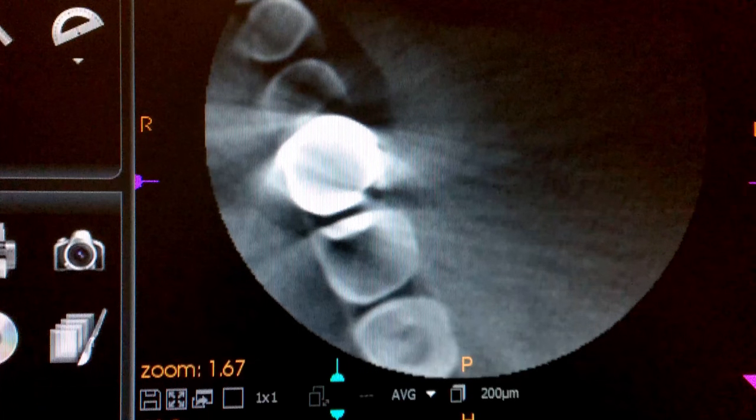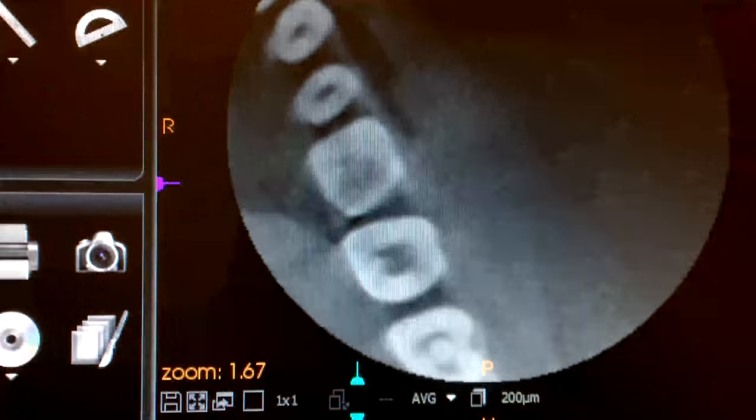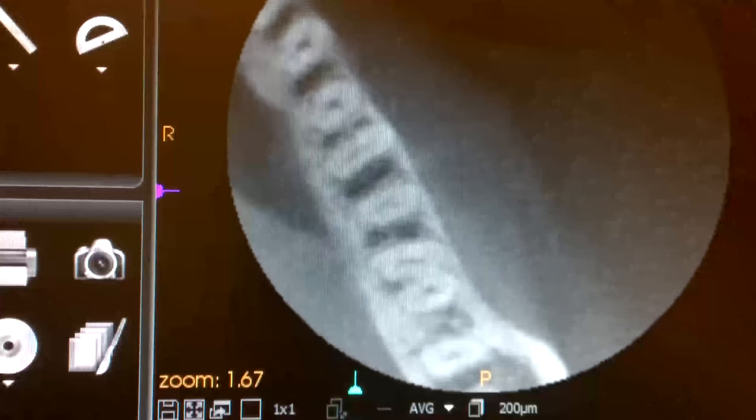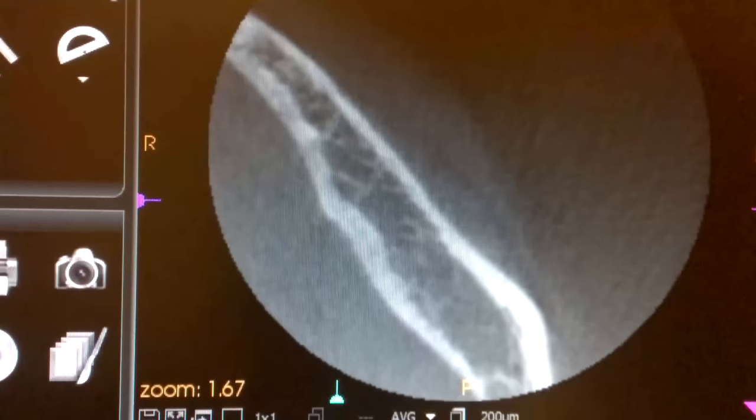On this cone beam, you can see the extra white area is actually a crown. As we continue to scroll down, you can just see the two roots there. Now we're down to only the jawbone.